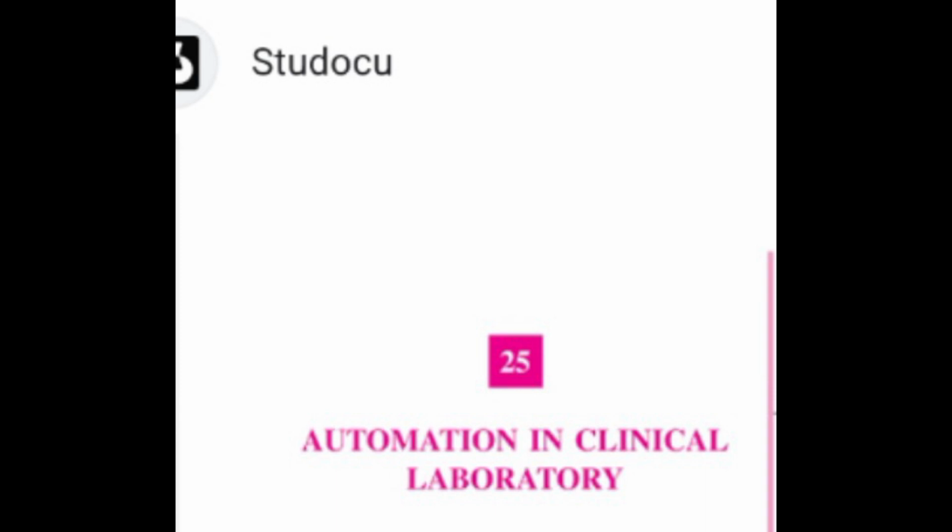Reagent handling and storage: reagents are stored in a plastic or glass container. They can be stored in laboratory refrigerators. If the assay is delayed, a refrigerator system can be introduced into the instrument as required. Reagent identification: the label on the reagent container includes information such as reagent identification, volume of content or number of tests for which the content of the container can be used. The reagent bottles are barcoded wherever the instrument has barcode readers. Reagent delivery: the liquid reagents are taken up and delivered to mixing and then the reaction chamber by either pumping via tubes or by positive displacement syringe devices.